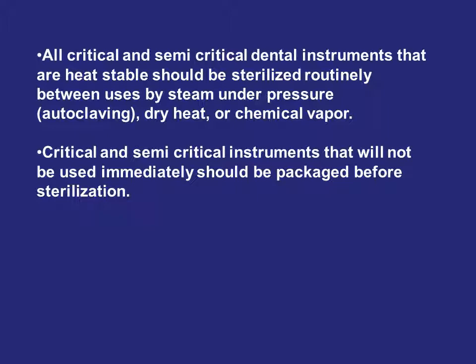Now we have to know what we mean by critical instruments. Critical instruments are the instruments that penetrate the soft tissue or come in contact with bone or enter the bloodstream, such as surgical instruments, periodontal scalers, scalpel blades, and surgical dental burs.